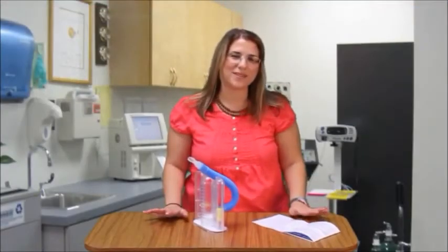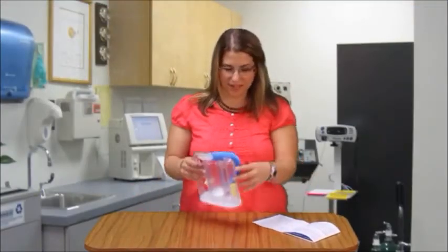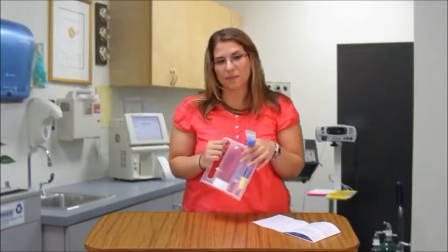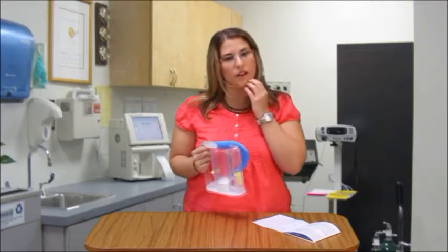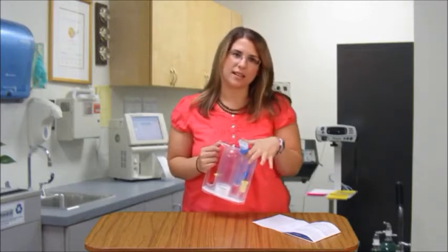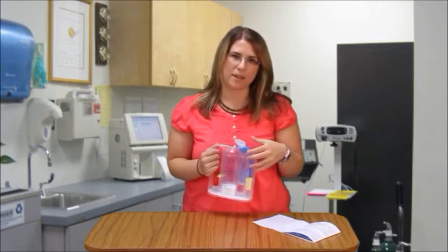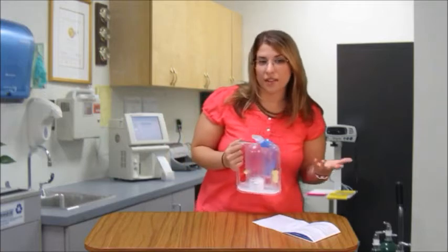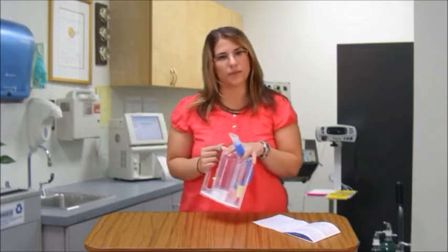Now we're going to talk about proper use of the incentive spirometer. This device is not best for everyone. Sometimes with COPD, or chronic obstructive pulmonary disease, this can be more harmful than helpful because you can have more air trapping. So you want to talk with your doctor or your physical therapist about if they think it's appropriate for you.